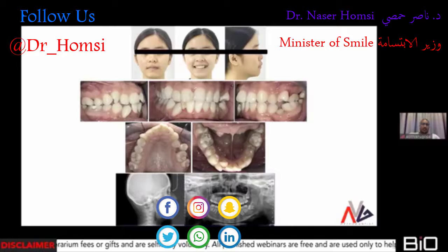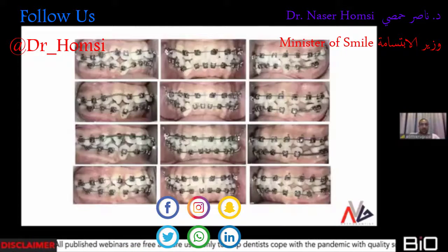The third example is this case again, where I had tried the same thing. Definitely, this is an extraction case, right? It's an upper and lower extraction 4x4 case, an open and shut case. But again, I went appliance driven. I placed in the appliance. I thought that I was going to be able to get the desired amount of expansion or proclination.